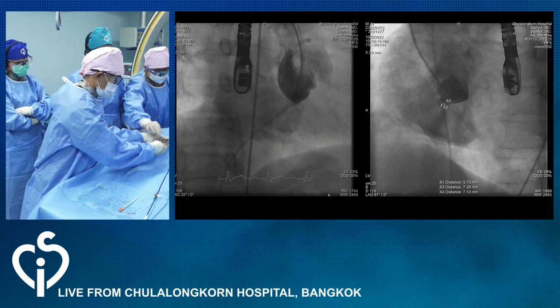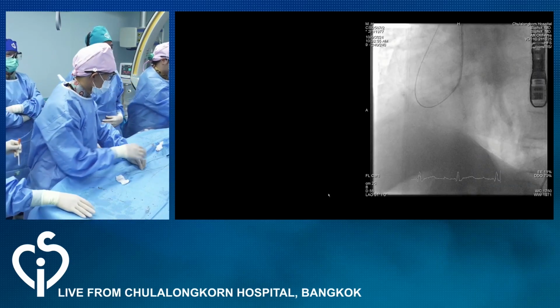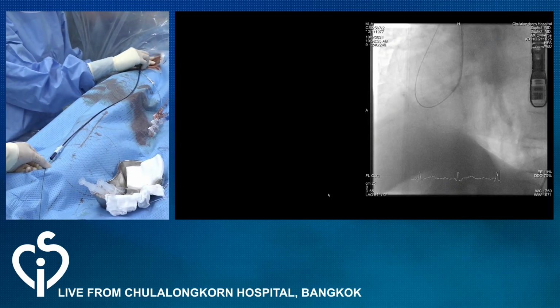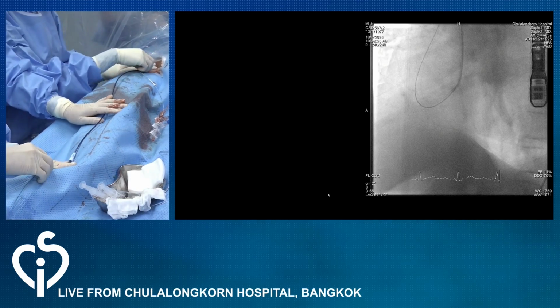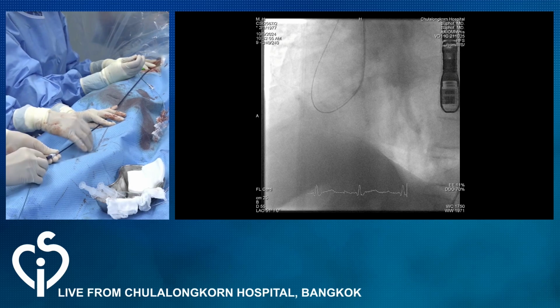Shabana first. I would have gone with an 8/6. Haysam. I would go with ADO2 6/4. Okay, ADO2 6/4. Tanabat. I agree with 10/8. Sanjeev. 10/8. All right. I would upsize to 8/6, the MFO. So we are being totally unhelpful. We've got two 8/6s and two 10/8s and one ADO2.